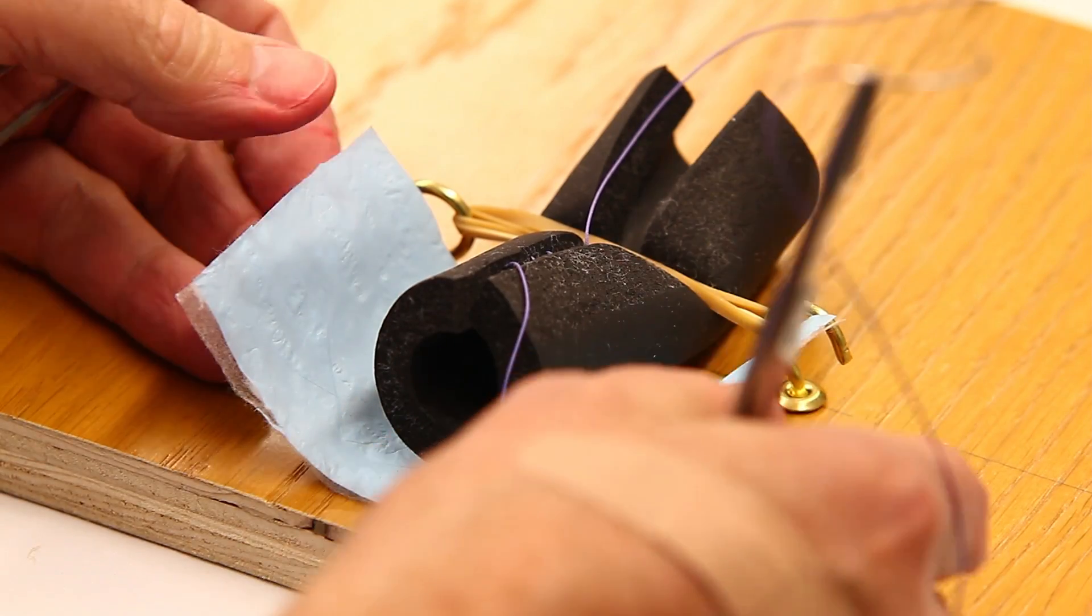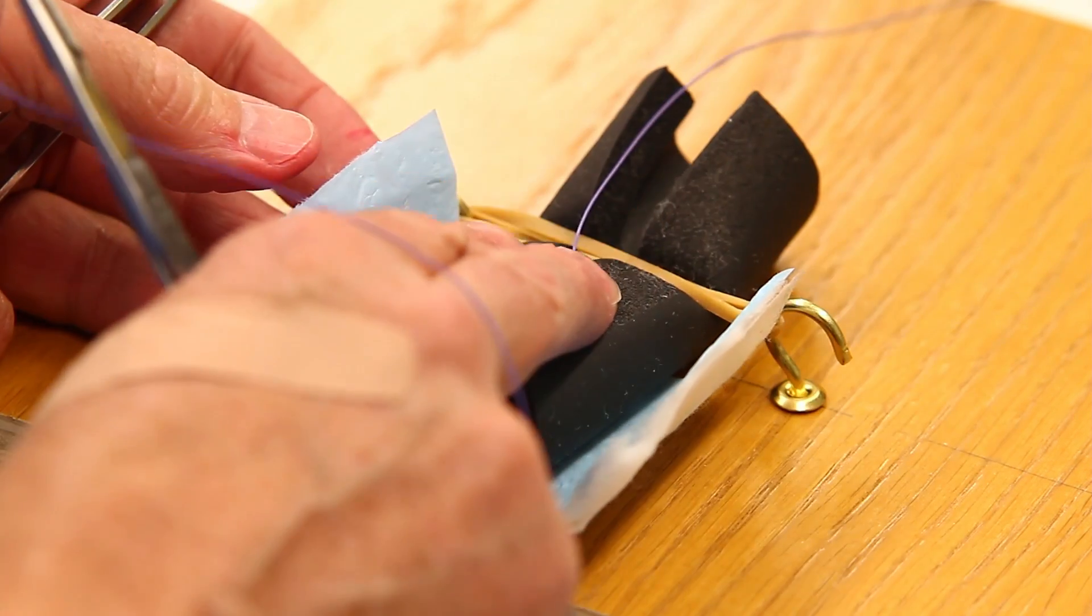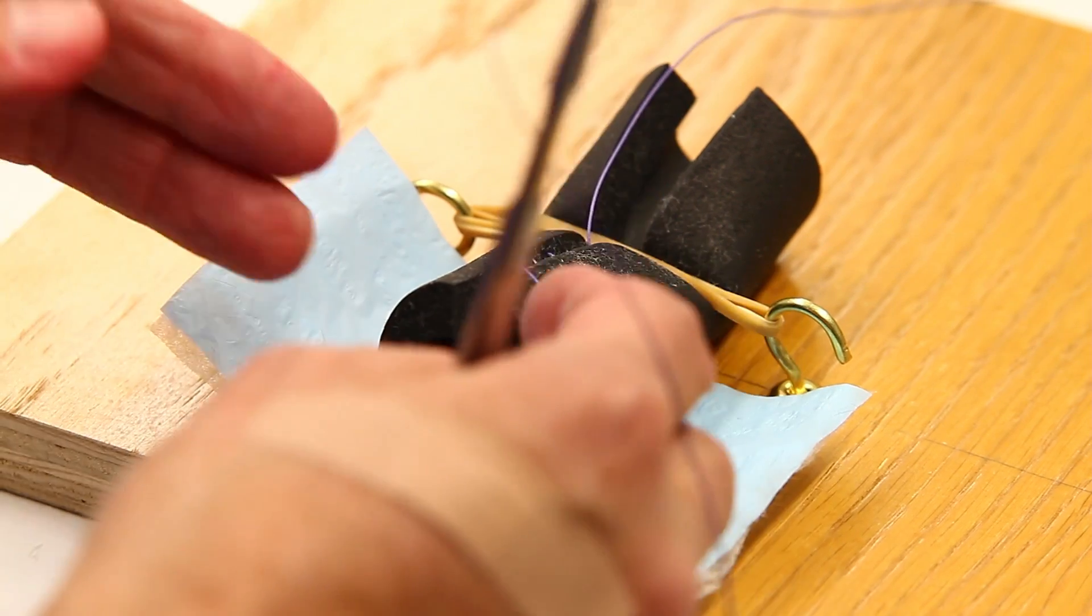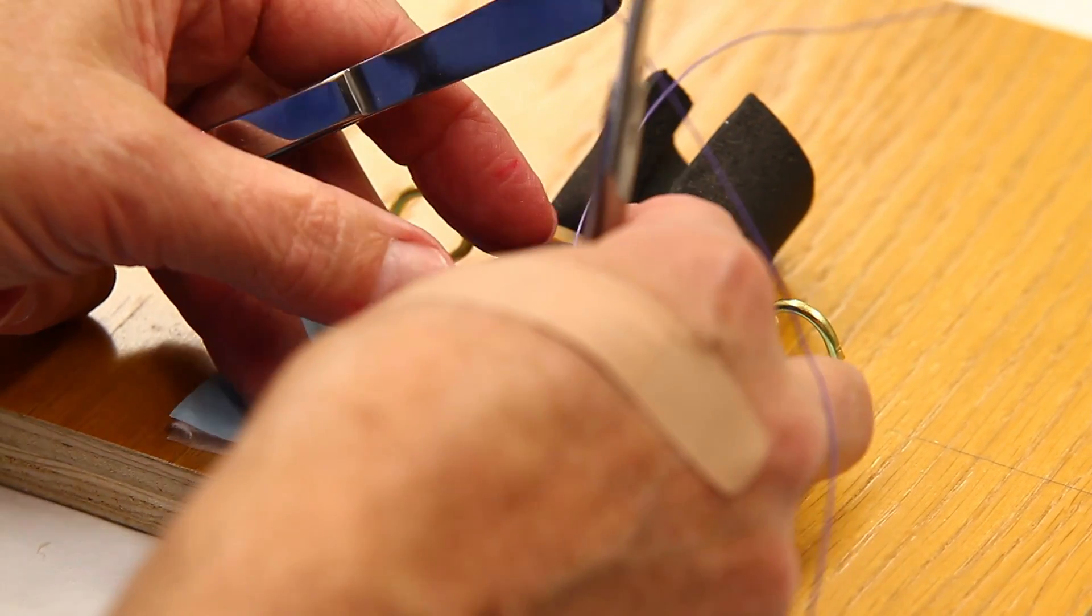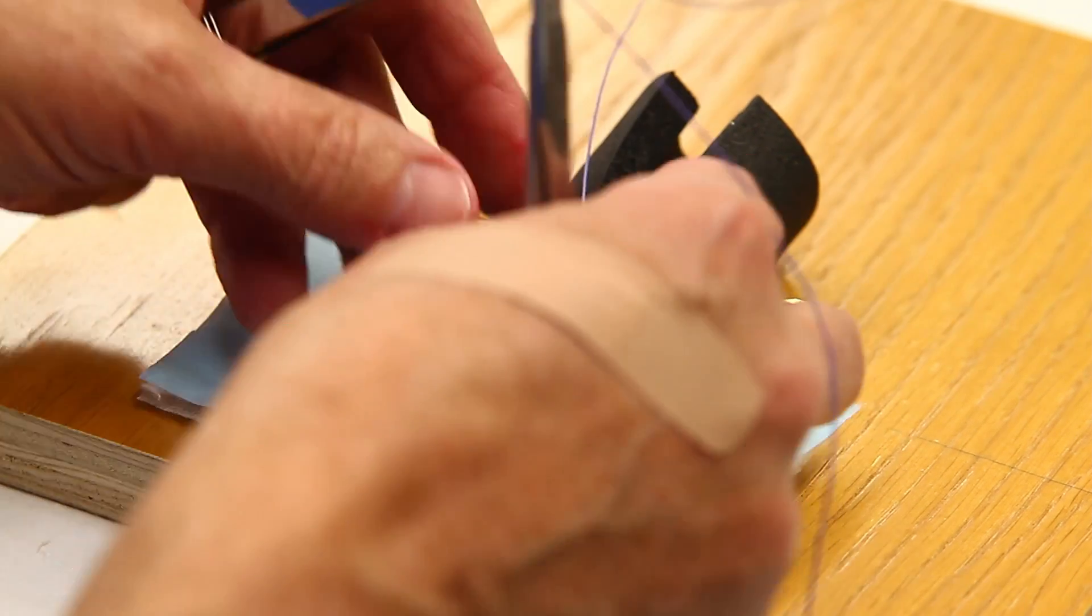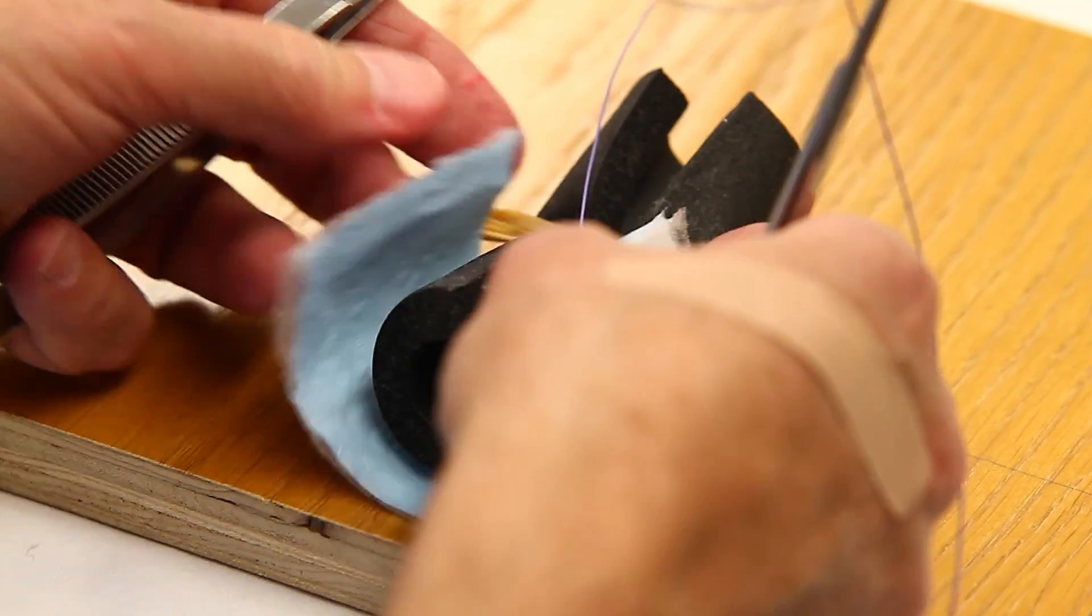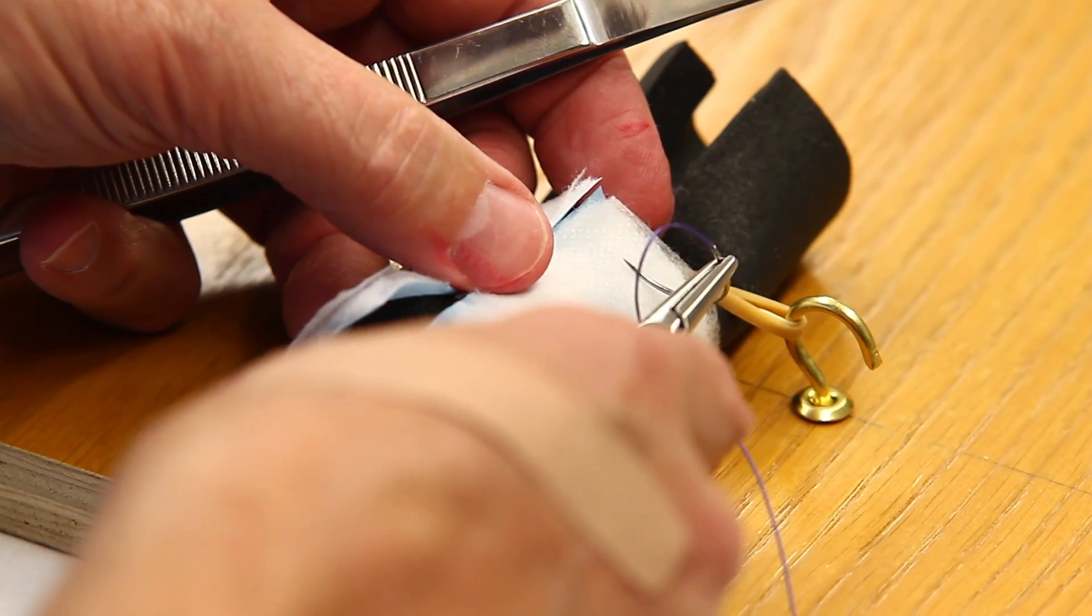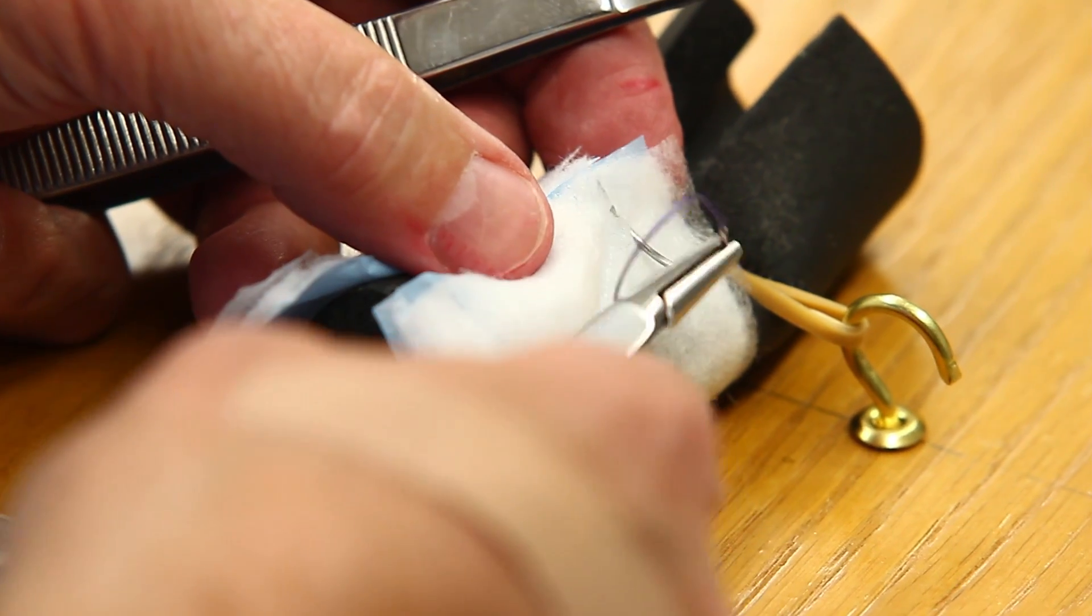This task is to approximate the internal rectal sphincter over our rectal repair. As noted in the previous portion of the film, we've closed this black pipe insulation in a delicate way. Now we're going to close over it the chucks pad that represents the internal rectal sphincter without penetrating the blue pad. So we skim along these connective tissue layers.